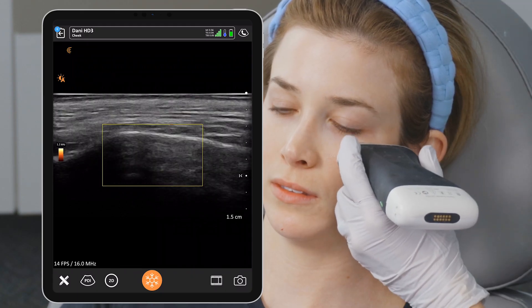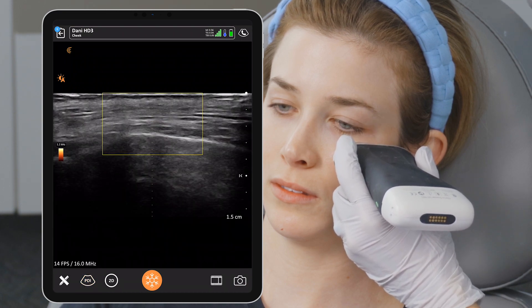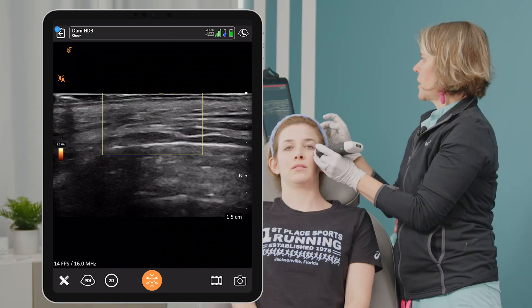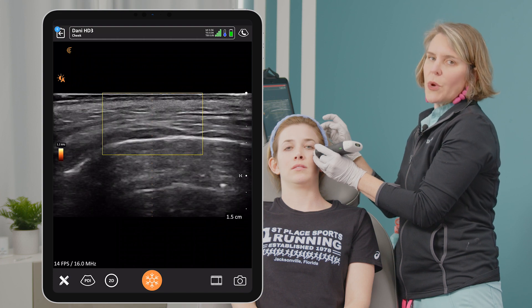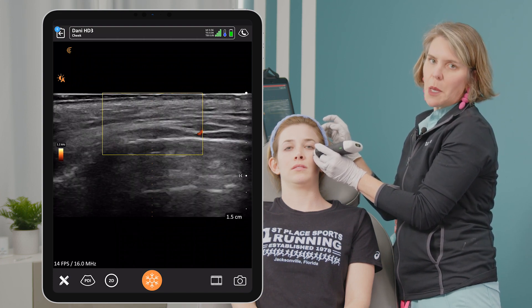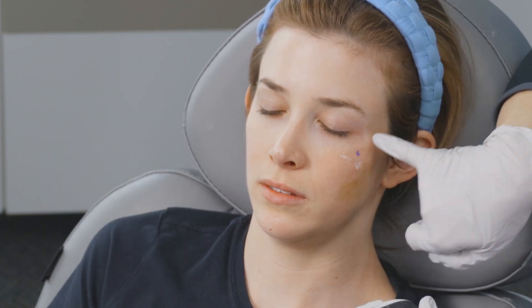We go to our Power Doppler and put our midline marker on, and that is going to be right on top of that little dot where we want to put our filler. Now we have to do our four adjustments, because we can't just throw a probe on somebody's face and say 'yep, that's safe.' We have to be very conscientious, which is why we put our dot here — and that's going to line up with our midline marker.